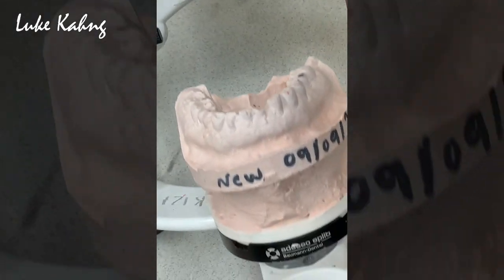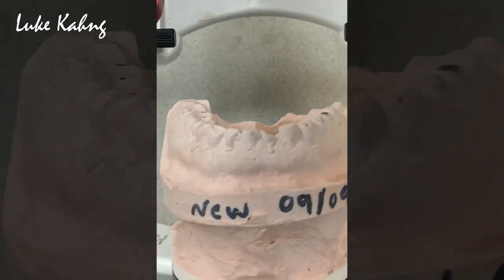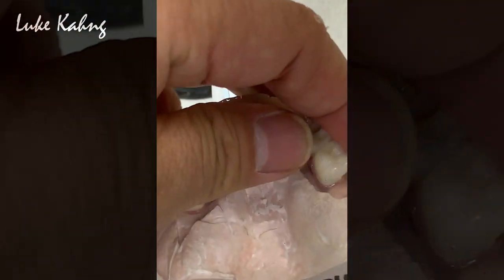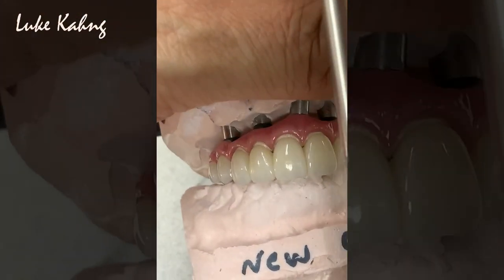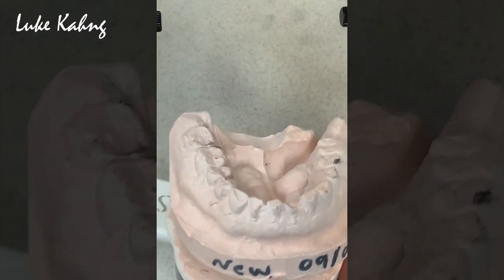You see, of course the patient's not going to give up. We have to increase the vertical dimension, but we're going to make the night guard longer as well after we print this. And you can get this, it opens the bite here. So we get the good occlusion contact here, also there, okay? Now we're going to increase the vertical dimension with the night guard. Unfortunately, we have to make the anterior open bite because the lower is almost demolished. All right, thank you.